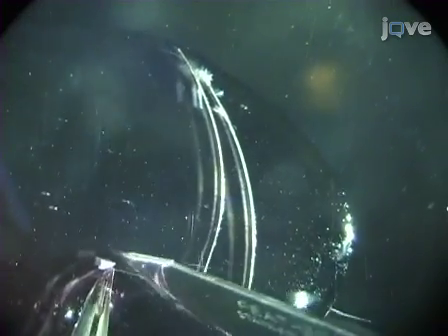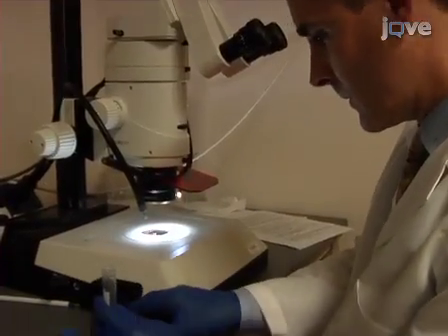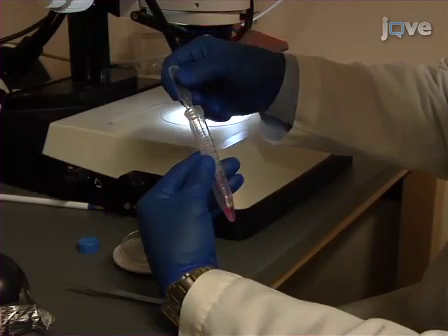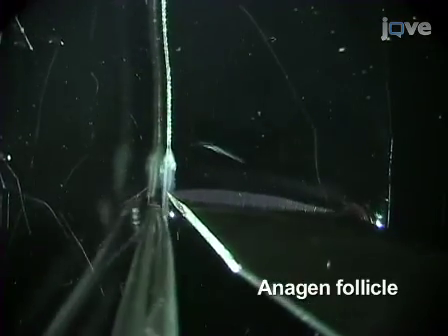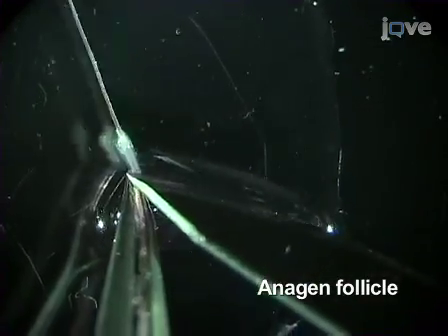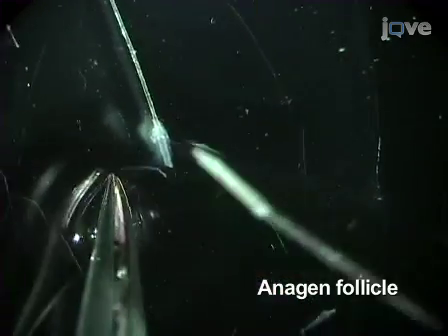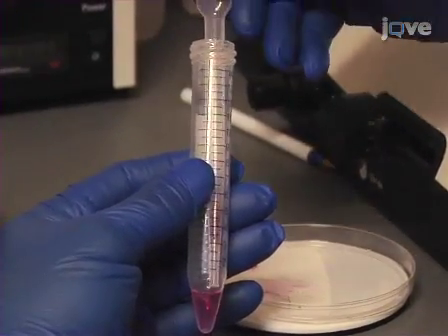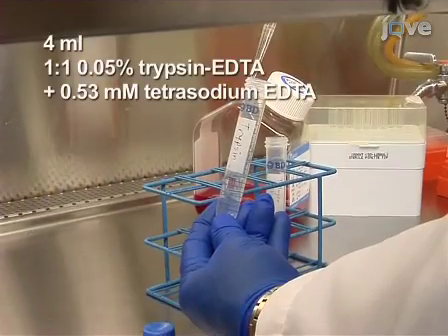Next, use a dissecting microscope to select follicles at telogen stage based on their morphology. Cut out the bulge region and transfer follicles into a 15 milliliter sterilized tube. Additionally, anagen follicles can be used: cut the upper one-third of follicles to obtain the hair follicle bulge region of stem cells, or cut the bulb region to isolate matrix transit amplifying cells, and add to the collection tube.